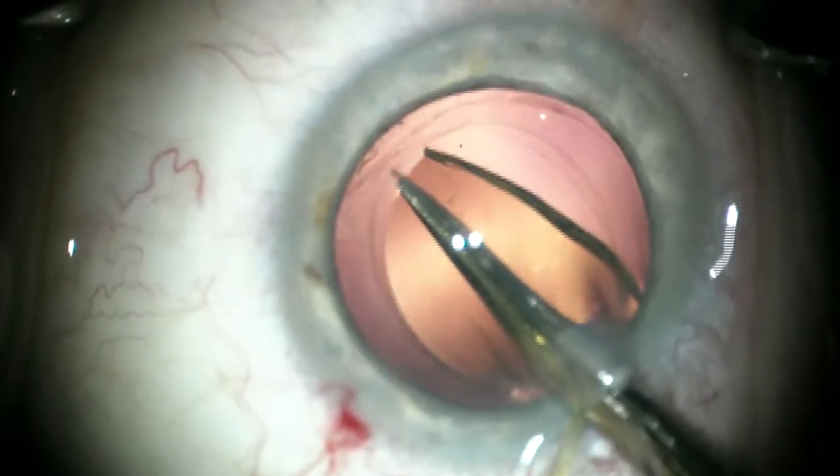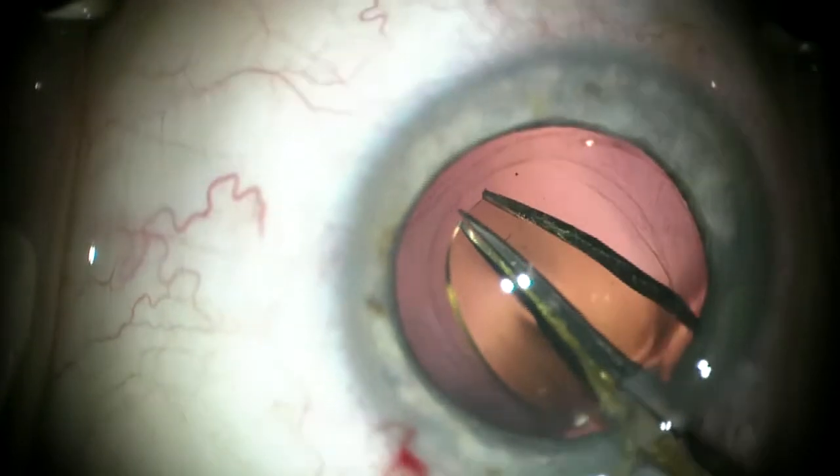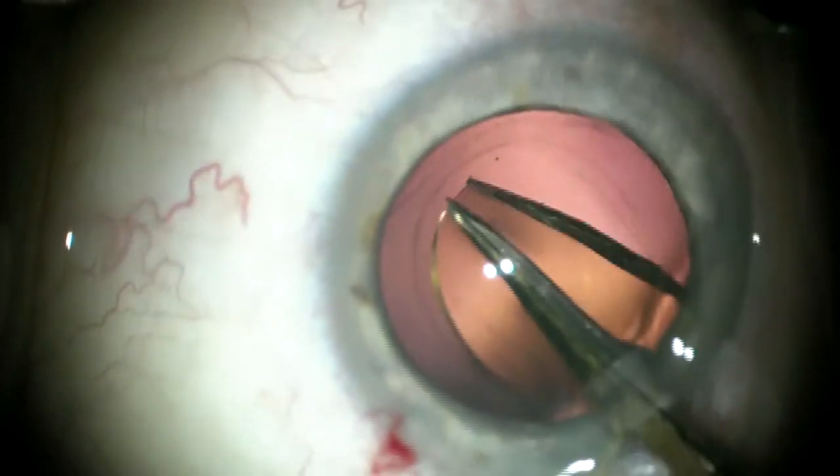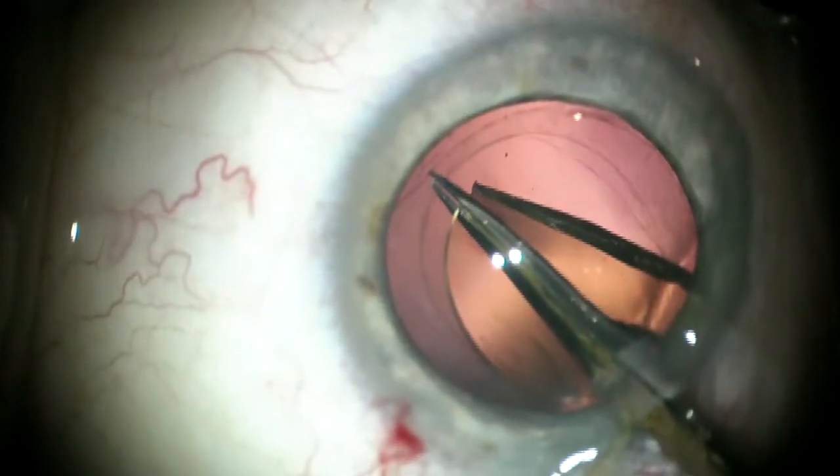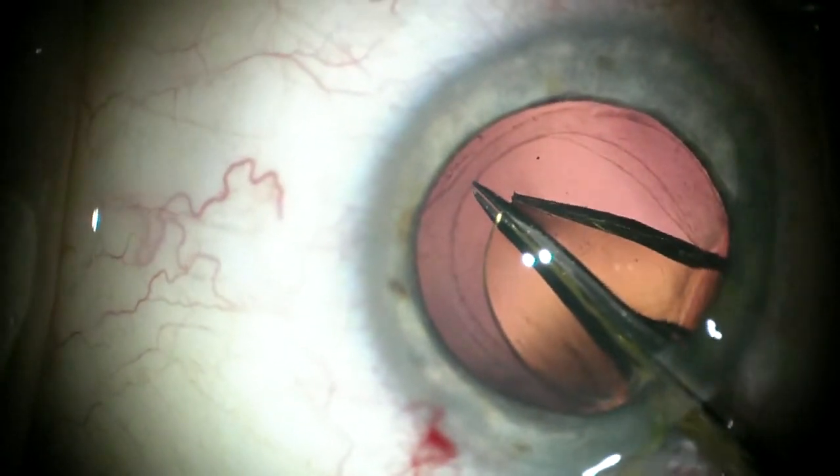As we get near the end, make sure we're not cutting the anterior capsule by lifting so we're above the capsule. You can't see that in three dimensions like you can with the microscope.